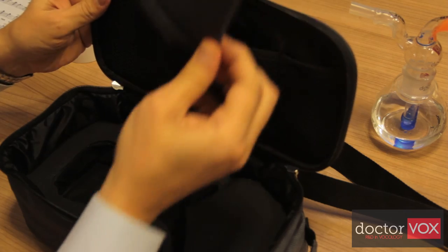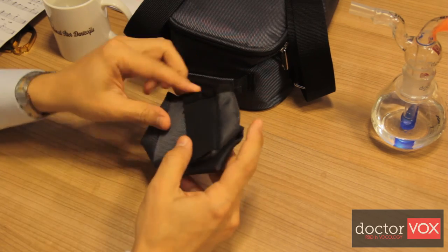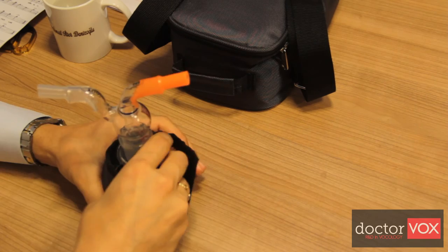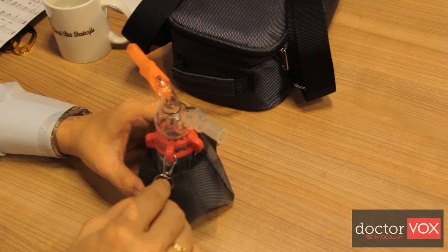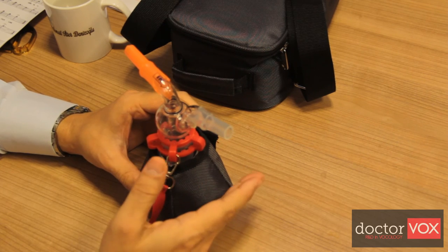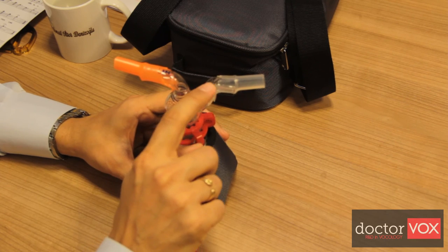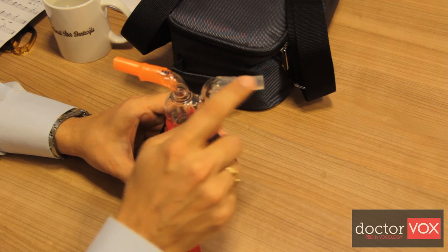There is another accessory in the Dr.Vox set: the thermos wrap. The thermos wrap can easily be mounted over the lower part of the device, the container, and helps to keep the water warm for a longer time in order to provide better inhalation. The air which comes through the phonation inlet comes out from the breathing outlet, so you can receive humidified air through the breathing outlet.